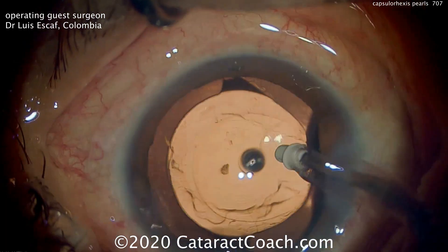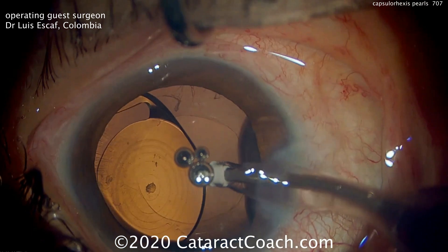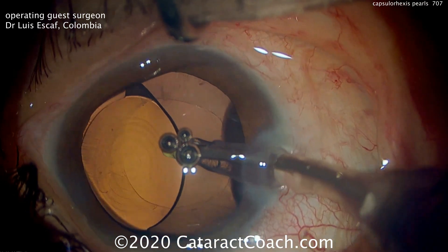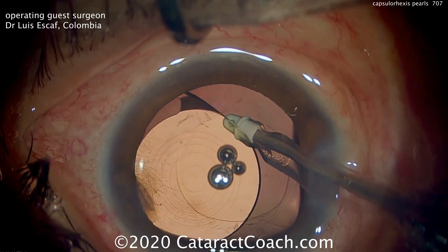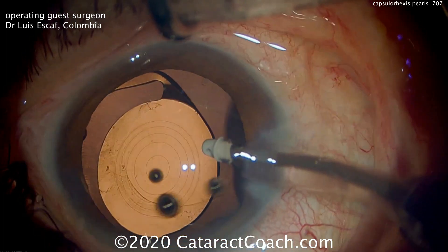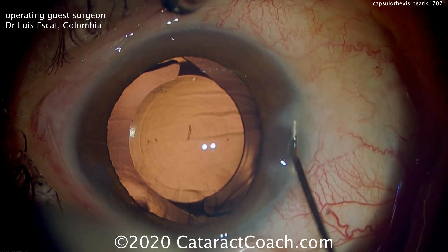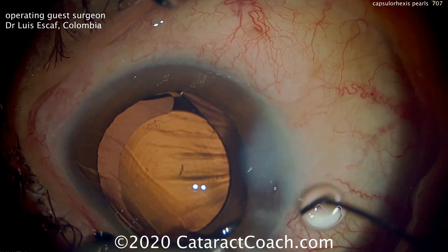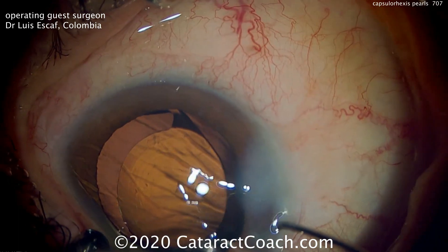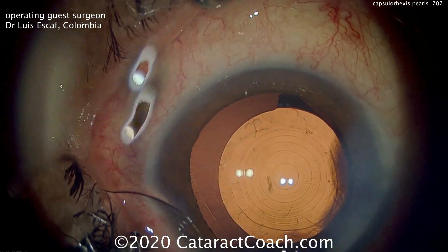In this case we have a very nice 5mm capsulorhexis. Going behind the lens to remove viscoelastic — that's important to make sure the optic is directly on the capsule, so it can be placed precisely, lining up those diffractive rings without the lens moving in the postoperative period. Hydrate the incisions and the lens will be nicely lined up.